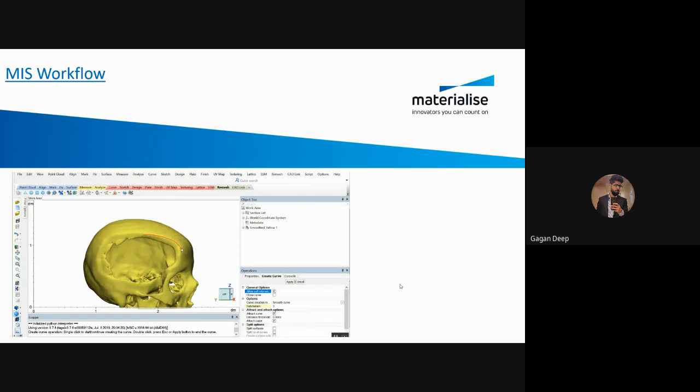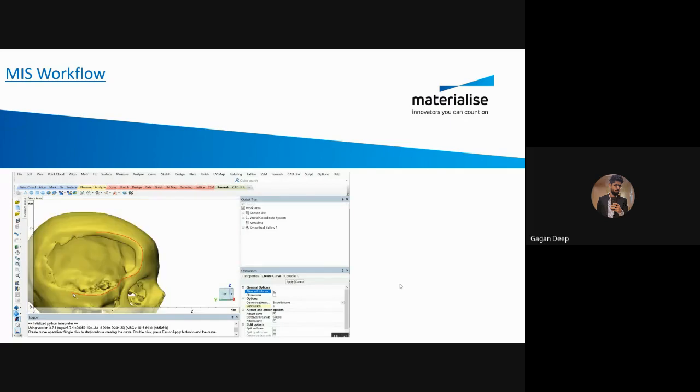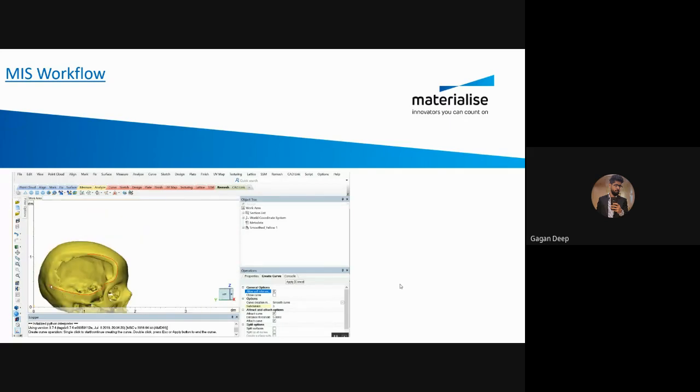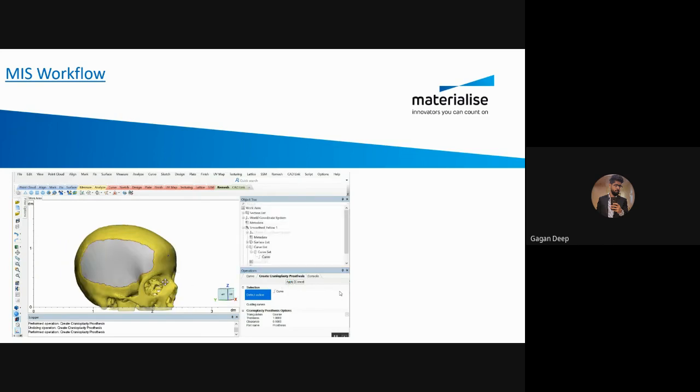Right now, what I'm doing here is defining a defected area. I'm telling my software, this is the defective area and I want a plate in this region. Once you define the defected area, there's an automatic tool here to create the plate like this.